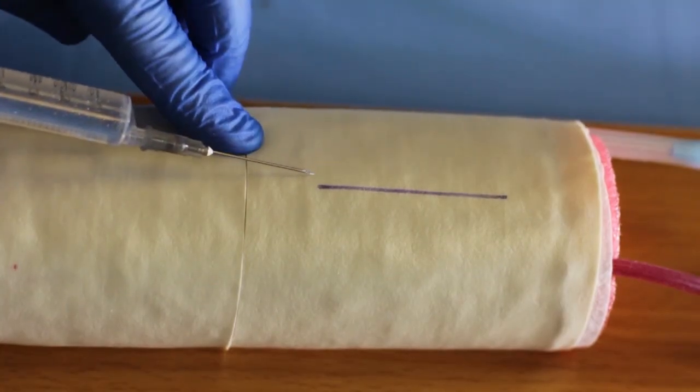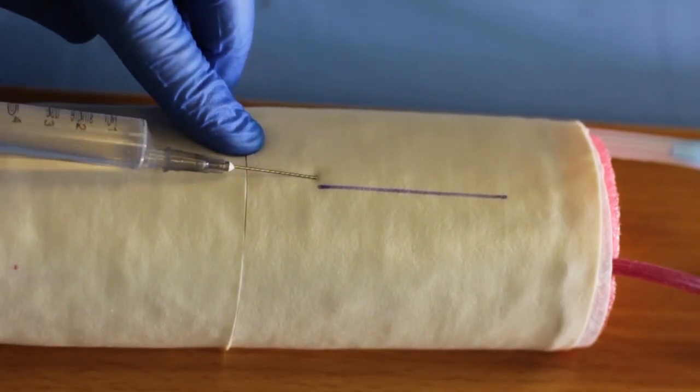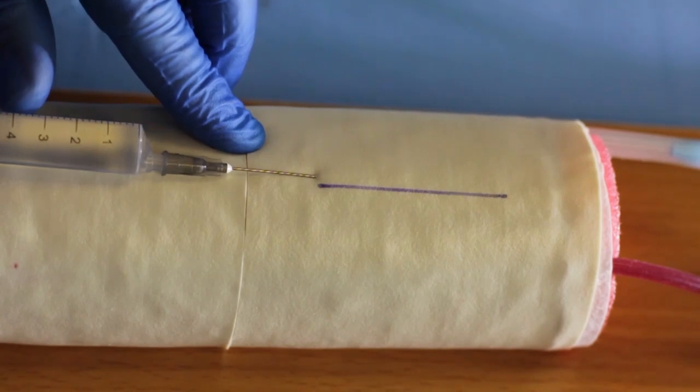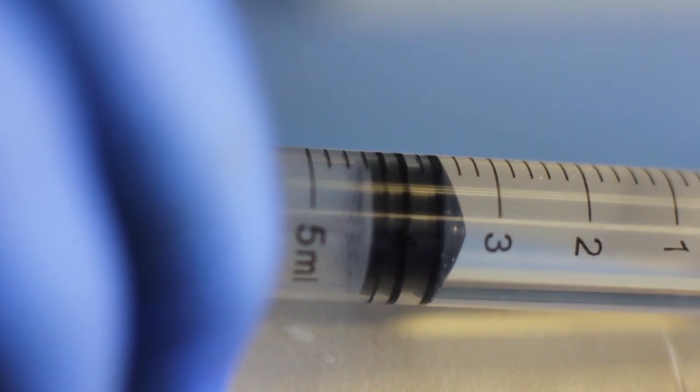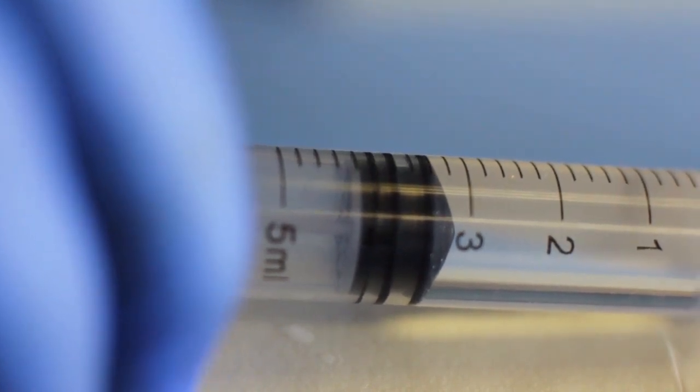Insert the needle into the tissue about 5 millimeters or one quarter of an inch away from the laceration, next to the beginning or end of the laceration. Deposit a drop or two of local anesthetic and wait for 30 to 40 seconds.